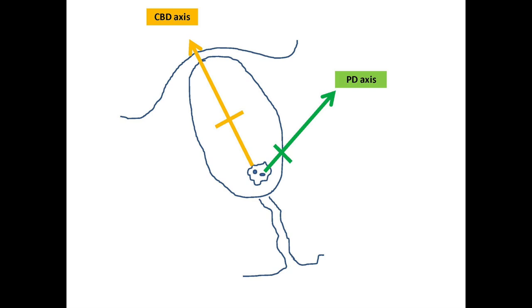You can see that the common bile duct axis is towards the 11 o'clock position and it's important that the catheter is orientated along the axis of the common bile duct.